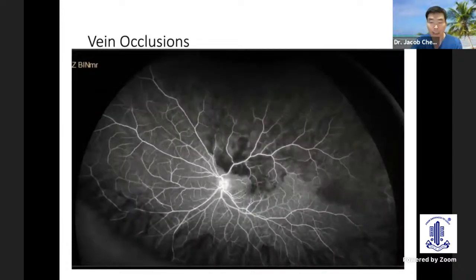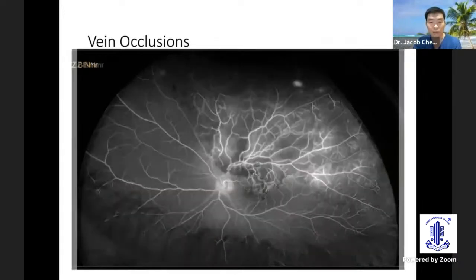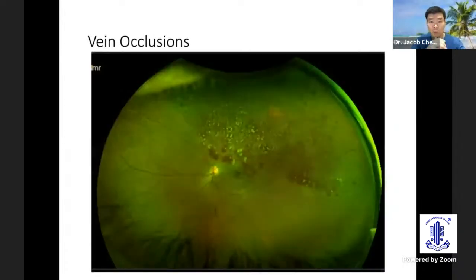Here, on the fluorescein angiogram in the early frames, you can see the delayed venous return, as well as ischemia, and capillary dropout in the later frames, capillary insufficiency in the late frames. Here, zooming in on the macula, we can see the macular ischemia of this patient who presented with poor vision.